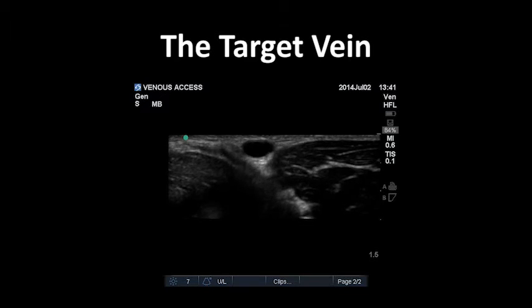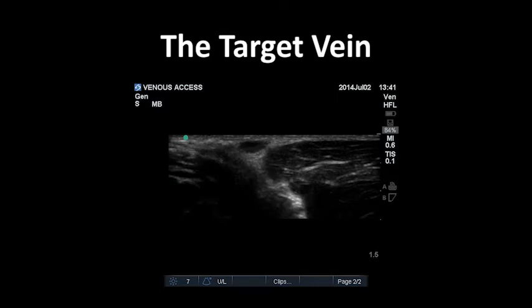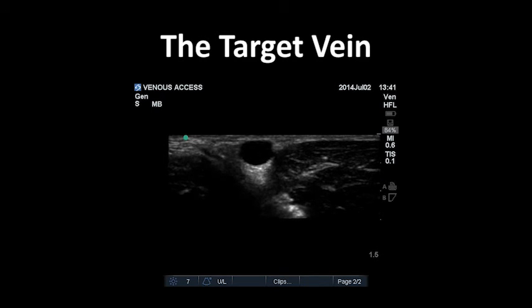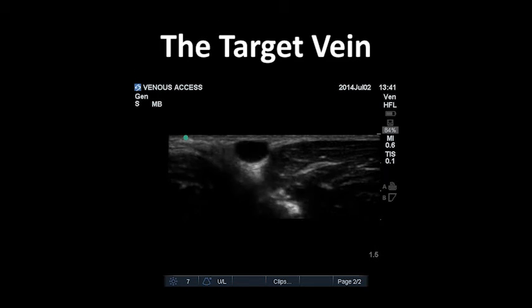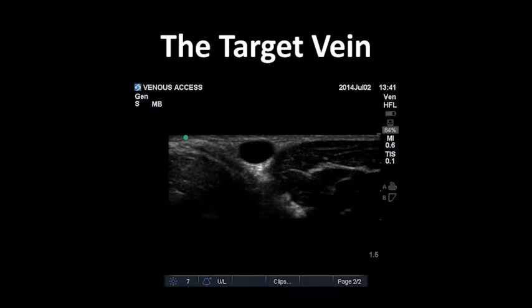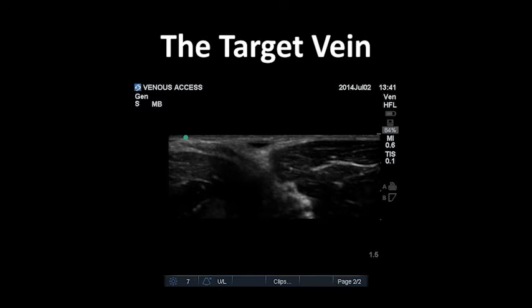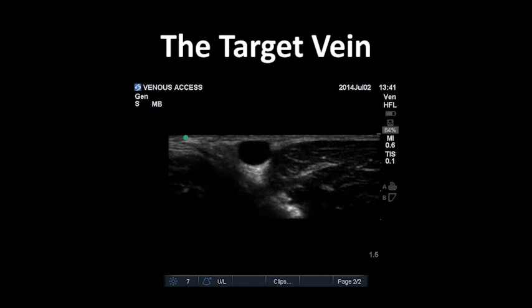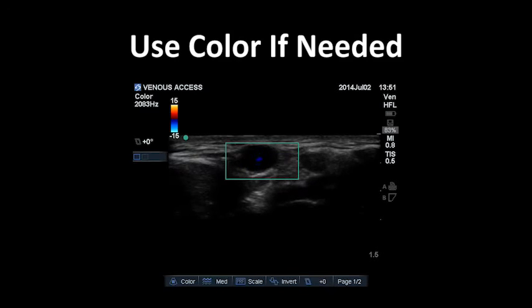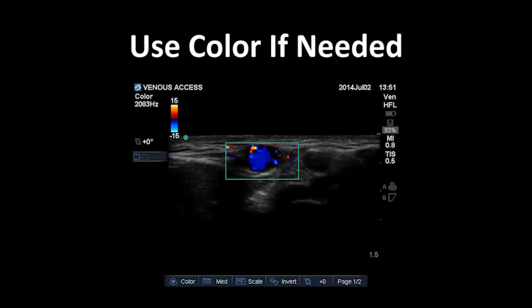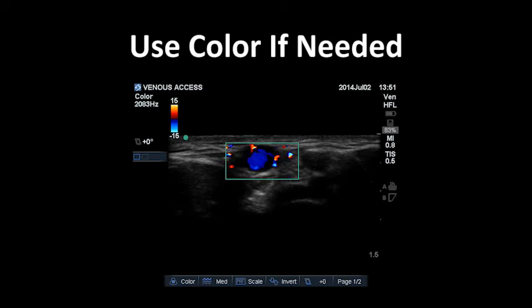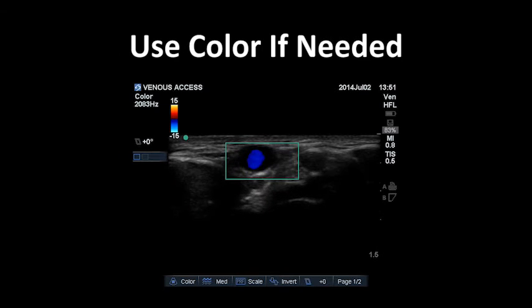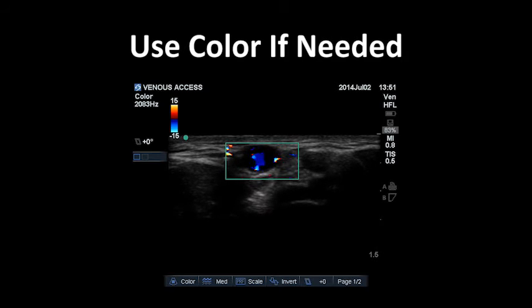Confirm your vessel of interest is indeed a vein by noting a thin-walled, hypoechoic structure with no pulsatility. Then confirm the vein is patent by compressing it using pressure applied with the probe — if the vein is compressible, then it is patent. If you are unsure if the target vein is patent or if it is a vein at all, press the color button and move the box over the vessel of interest and look for color flow inside the structure to confirm that the vessel has flow.